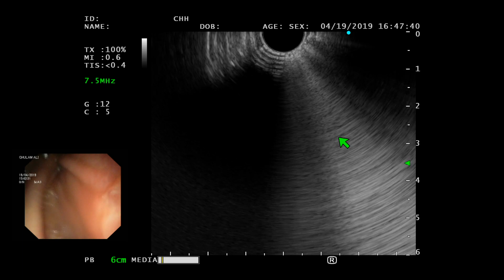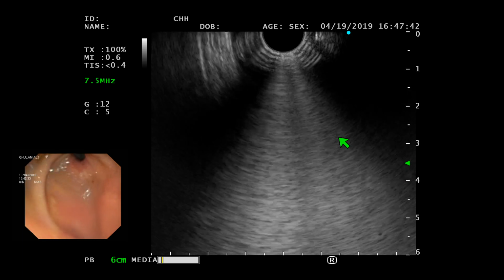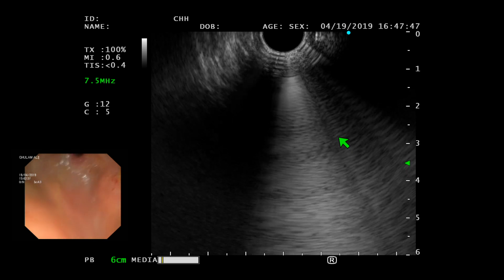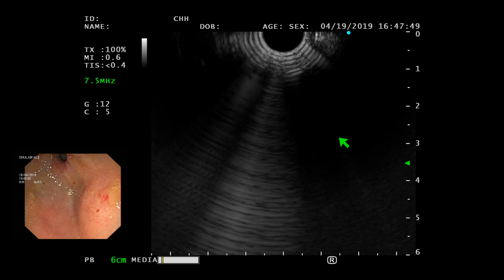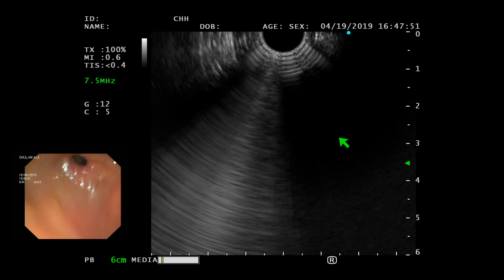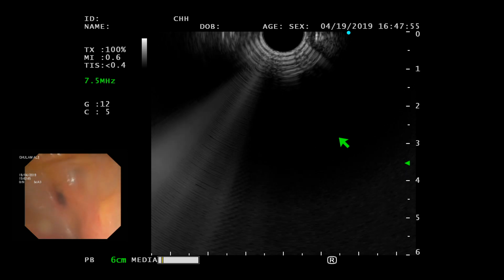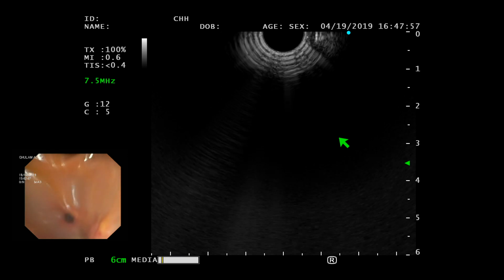So we will inflate this. So when you saw the gallbladder the second time, it appeared from a different area. Yeah. That means you're looking at it from a different station. Okay. So then you need to adjust yourself and take a look with the endoscopic view.